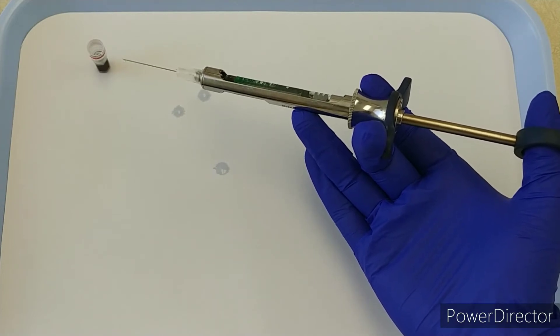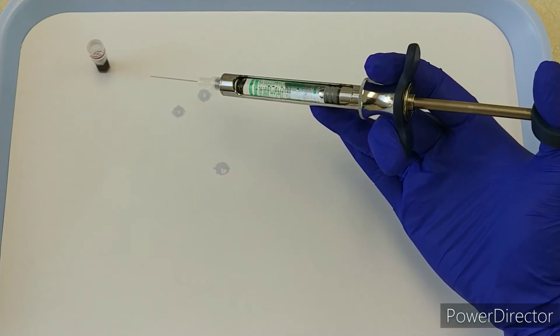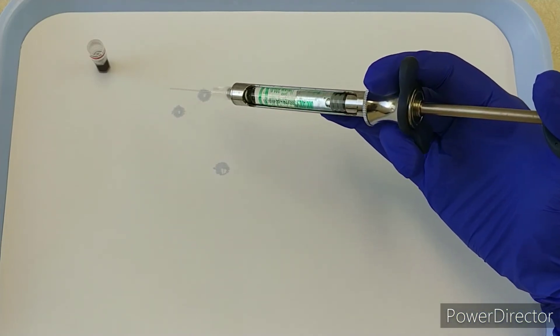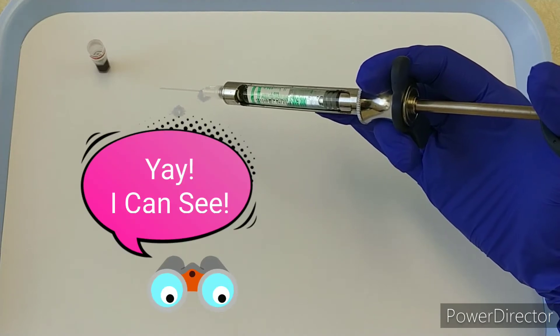That way, as I rotate a quarter turn, I'll end up with the big window facing me and I can really see when I'm depositing. That's a nice thing about considering that before you get started.